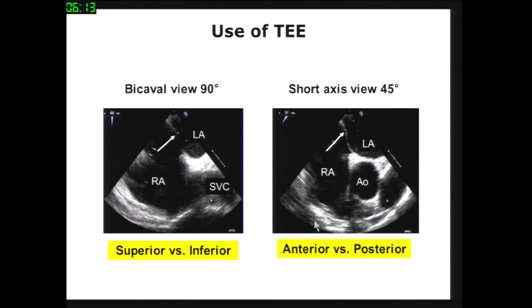This is a representative TEE image during septal puncture. In the bicaval view at 90 degrees, we can see the LA, RA, and SVC, and localize the fossa ovalis to judge whether the puncture is superior or inferior. In the short-axis view at 45 degrees, we can see the LA, RA, and aorta transversely, localizing the transseptal puncture as anterior or posterior.